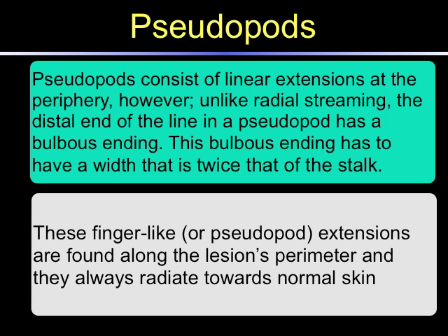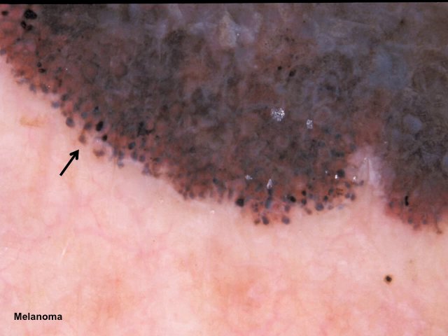As is the case with any streak, these finger-like or pseudopod-like extensions are found along the lesion's perimeter and always radiate towards uninvolved normal skin. Here is an example of a melanoma displaying pseudopods. The arrow points to a linear extension of streak emanating from the tumor, consisting of a stalk with a bulbous ending. Notice that the bulbous ending has a width more than twice that of the linear stalk from which it originates — the characteristic morphology of a pseudopod.